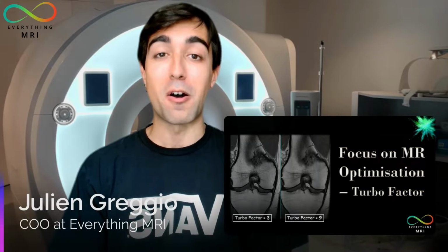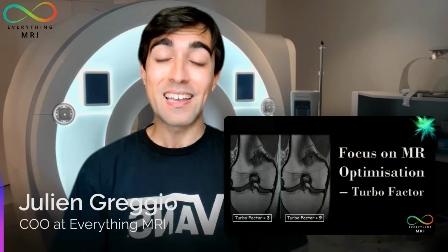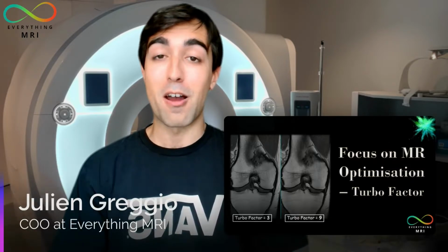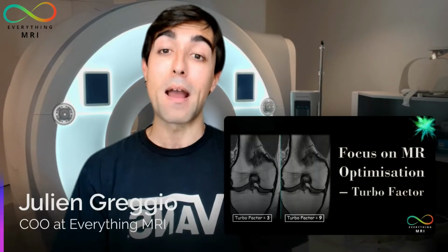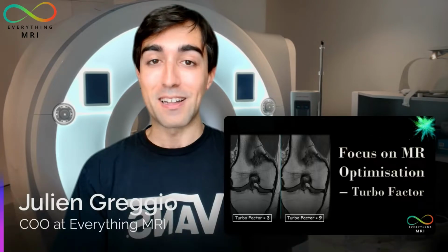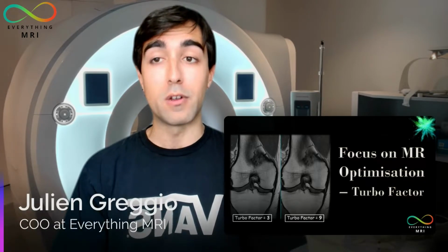The plan for today is continuing our focus on MR optimization, and this will be done by illustrating the features of a parameter that plays a key role in the routine MRI workflow. And I'm talking about the turbo factor. I'm pretty sure many of you have tried at least once to speed up the scan by manipulating this parameter. So, what are the advantages and the drawbacks of doing that?